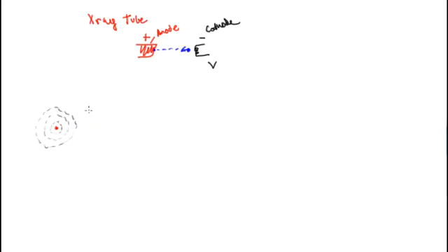If I could go in close enough, I would see an atom like shown here and the electron coming in towards it. As it comes towards it, as you remember, it gets bent around the nucleus, and in that process it's going to make radiation. This is the Bremsstrahlung, breaking radiation coming off here like this.